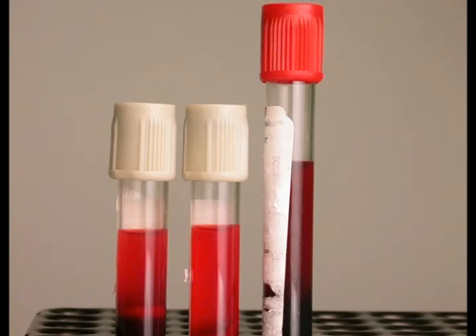Hemolysis is the most common reason chemistry samples are rejected. Often preventable, it occurs when red blood cells rupture and release their hemoglobin into the serum or plasma. Hemolysis imparts a red tinge to serum or plasma and interferes with the accuracy of many blood tests.